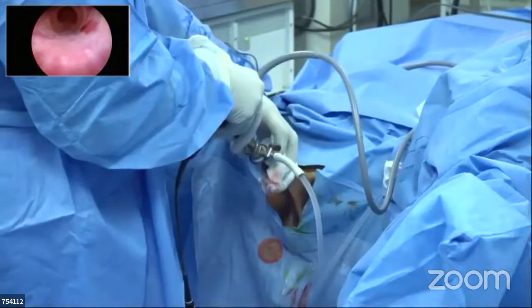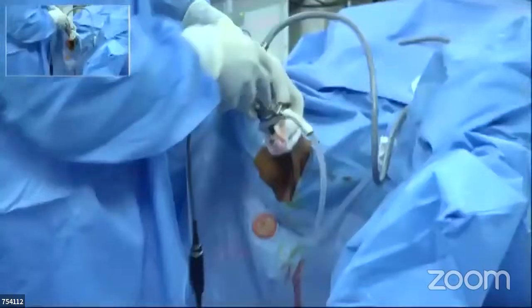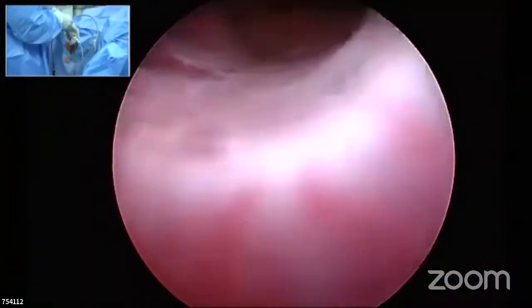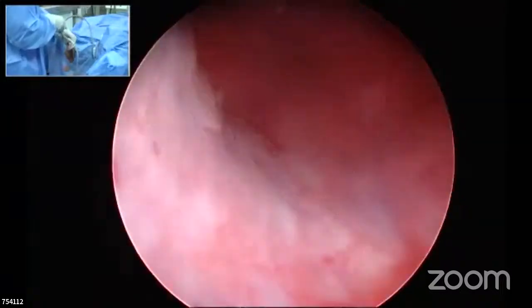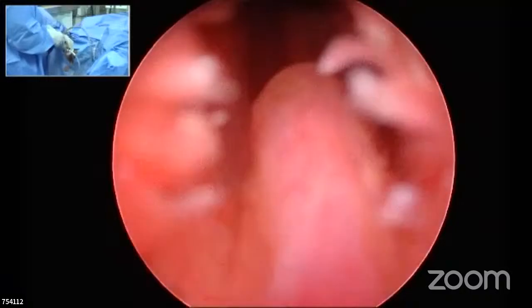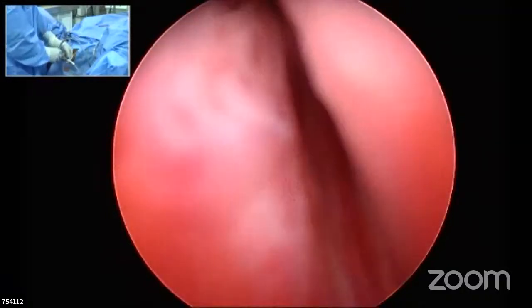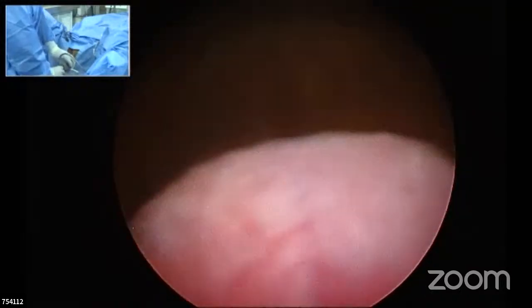Are you getting an endoscopic picture now? Yes. Can you make a big view? Yeah, fine. Okay. So I've done a cystoscopy. The anterior urethra is normal, the pendulous urethra is normal. I came to the sphincter area, and this is the verumontanum, and that is an enlarged gland, and that's a median lobe which is existing there.